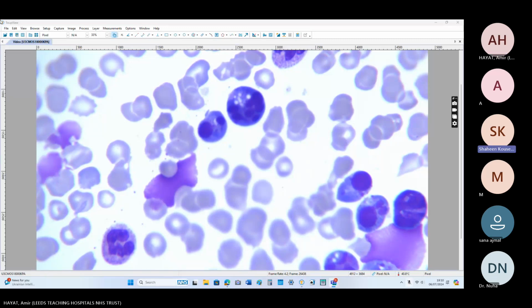It's unlikely to find these disintegrating cells and mitotic cells in the peripheral blood. This is the original blood film. So the most likely diagnosis is a high-grade lymphoma, likely Burkitt lymphoma.